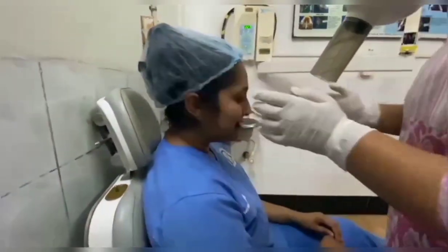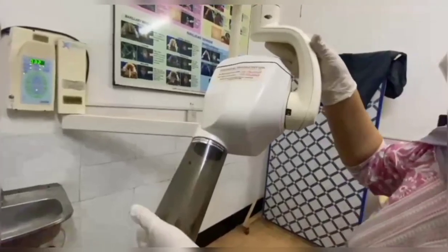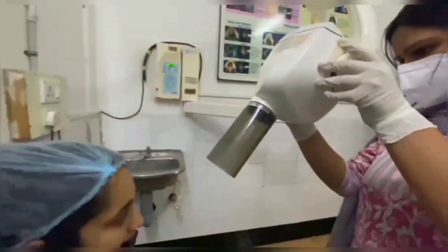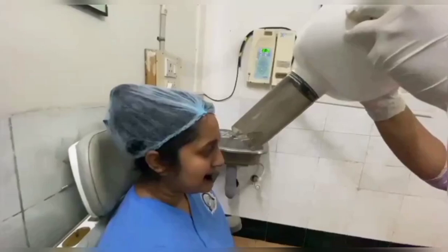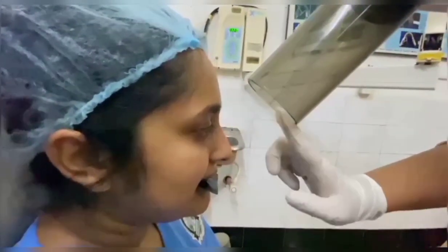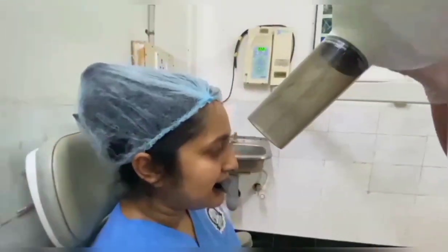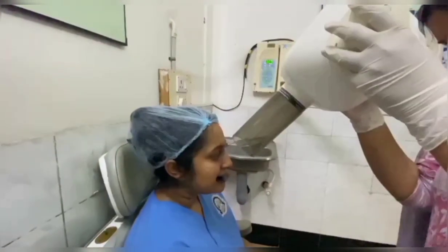The patient's head must be positioned so that the upper arch is parallel to the floor and the mid-sagittal plane is perpendicular to the floor. A horizontal angulation of 0 degrees and a vertical angulation of plus 45 degrees has to be given. The PID is positioned in such a way that the central ray enters the patient's face through the tip of the nose. The primary field of this projection includes the anterior maxilla and its dentition. It also includes the anterior floor of the nasal fossa and the teeth from canine to canine.